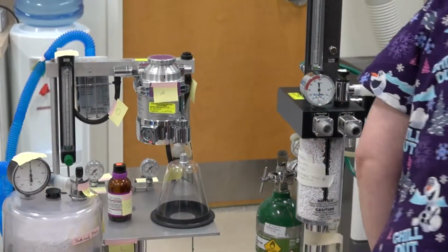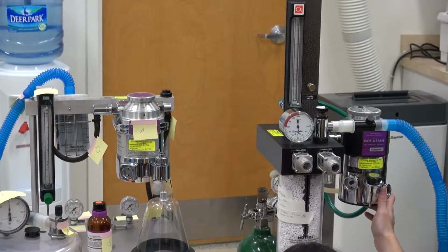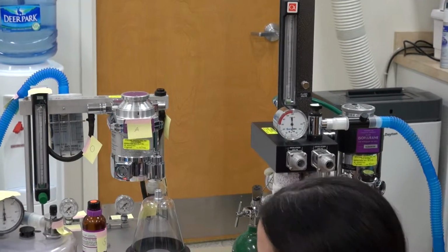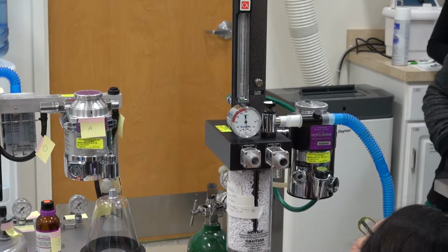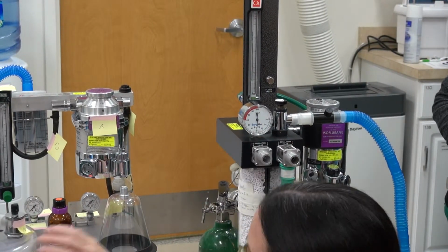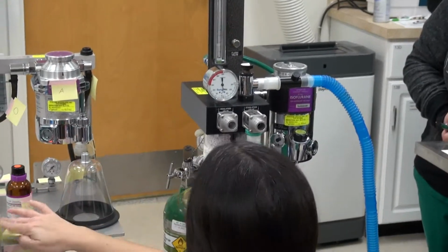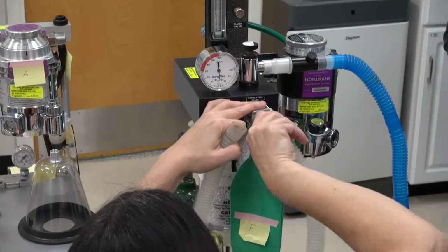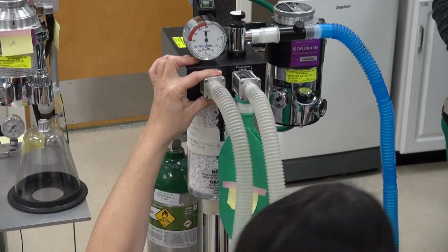Do we have a bag on this machine? Where am I? Stacey, where is my? Oh, here we go. It's in here. There's a couple bags there. Thank you. So my bag's going here. And then my hoses are going to go here. Alright, so my hoses are on, right?